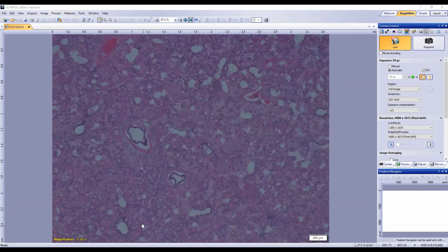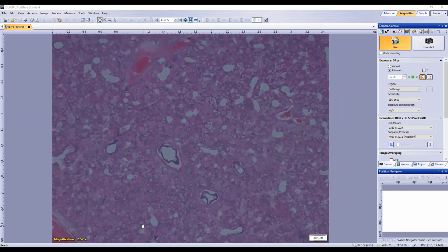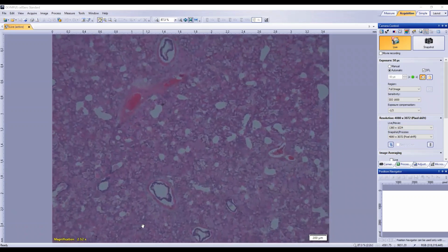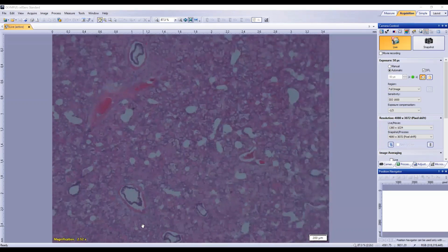So now I'm just checking the time. We're at 5 to 11, so we'll try and wrap this up soonish so that everyone can get away on time. But at the moment we're looking at probably a subacute interstitial pneumonia. Let's dive down and have a look at a few more things, see if we can nail down a more likely etiology.